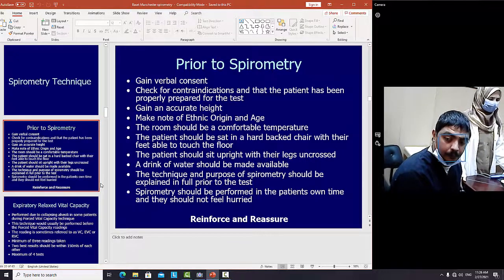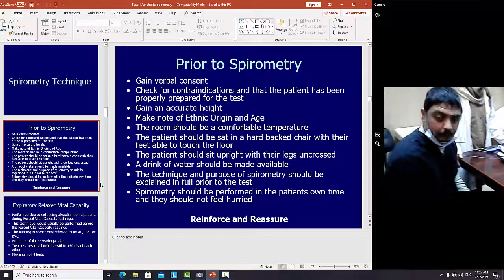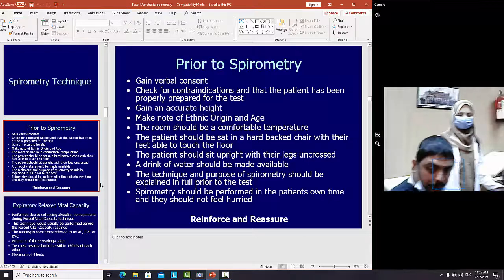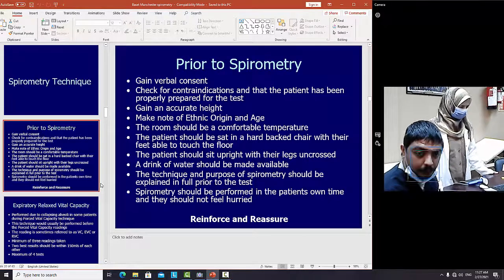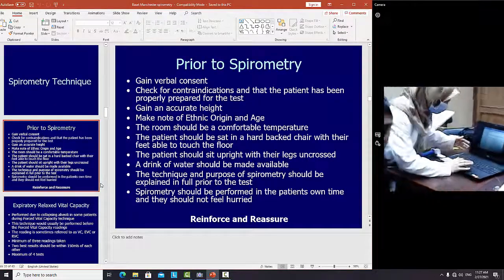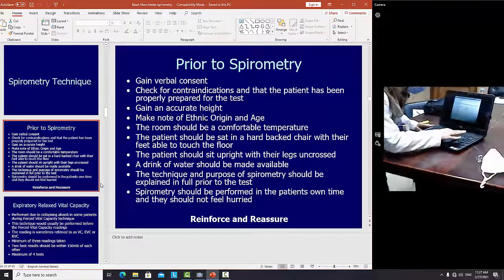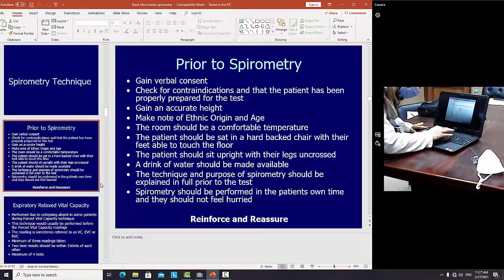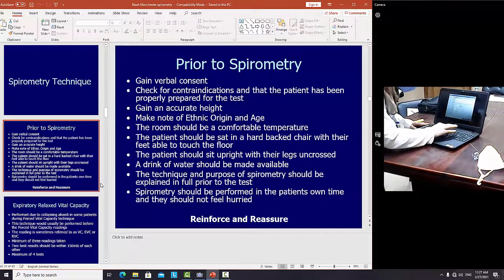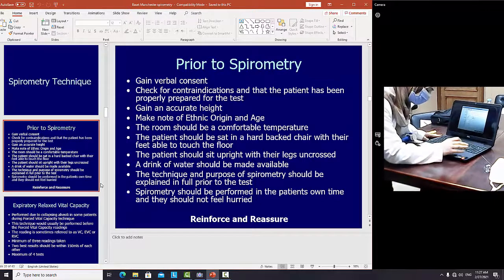The patient data includes age, height, and weight, and the computer can calculate the body mass index for this patient. Ines enters the patient's data into the computer. After that, the computer software calculates the predicted pulmonary function for the patient.